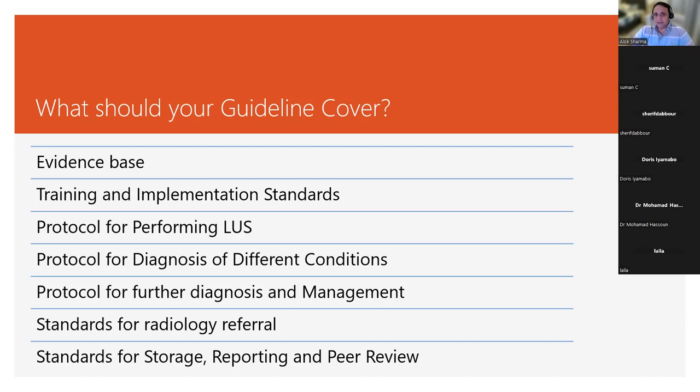And I think that's the challenge, because a lot of pediatric radiology departments, really, from our perspective, are not able to support us because they've not trained in point of care lung ultrasound. But really, they may still be very important in us being able to make an interpretation in terms of what further imaging may be required.